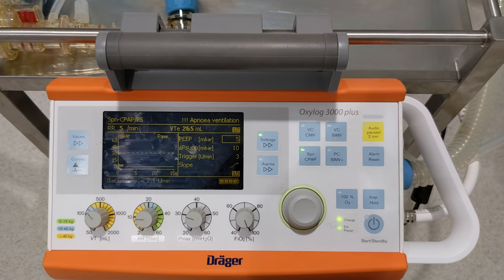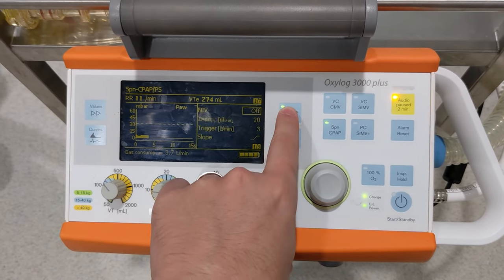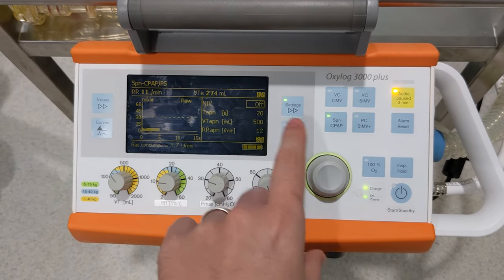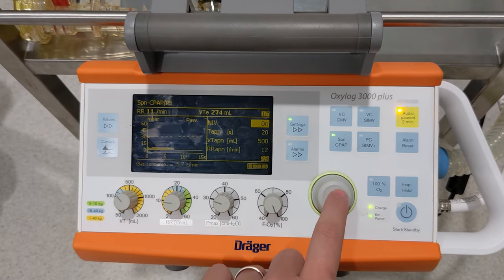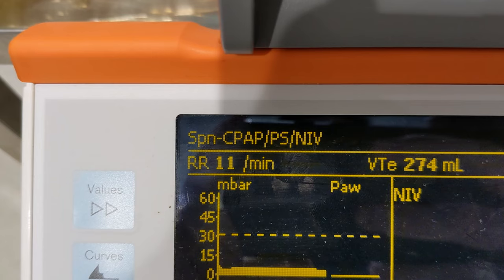Next, we have to set the OxyLog to function in NIV mode. Start by pressing the settings button once to get to page 2 of 3 of settings. There you'll see a setting that says NIV, which starts as off. Select it with the rotary knob, change it to on, and confirm by pressing down. If everything's working correctly, you'll see the title change in the top left corner to show SPN CPAP/PS/NIV.